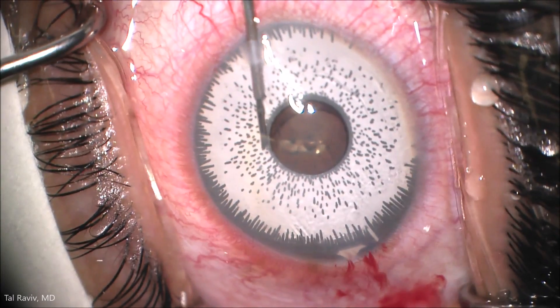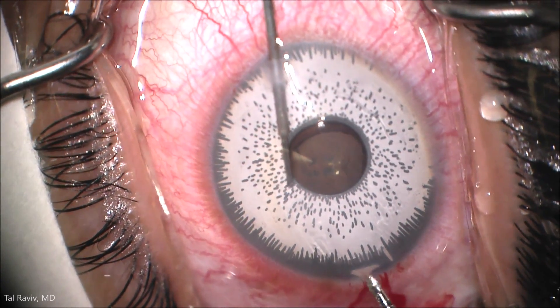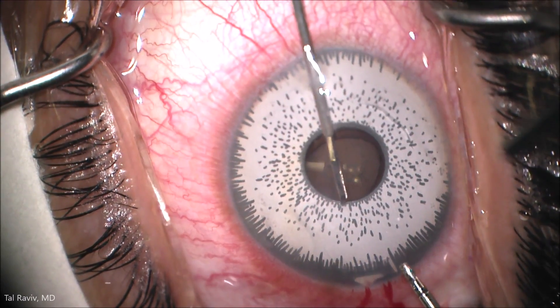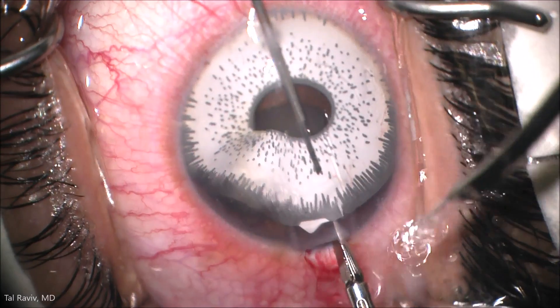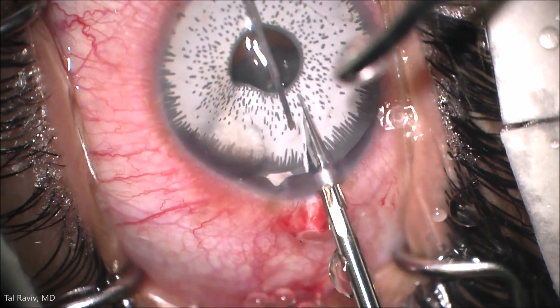The patient's endothelial cell count was around 900, which is significantly lower than normal. A 25-gauge end-grasping forceps is then used to first grab and then carefully retract the implant, and allow micro scissors to transect the implant.